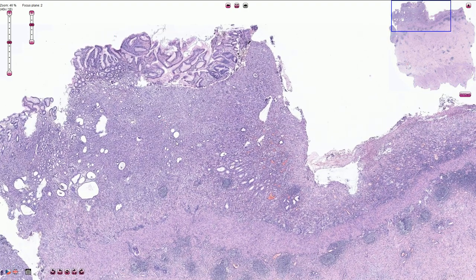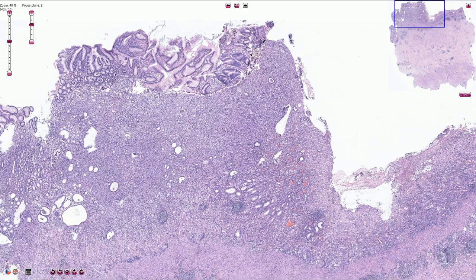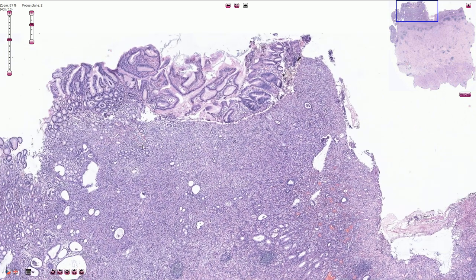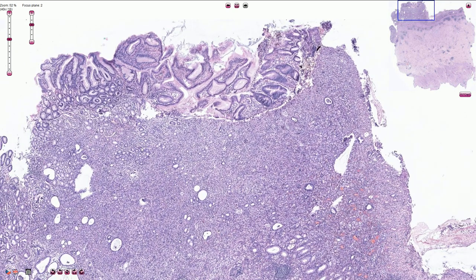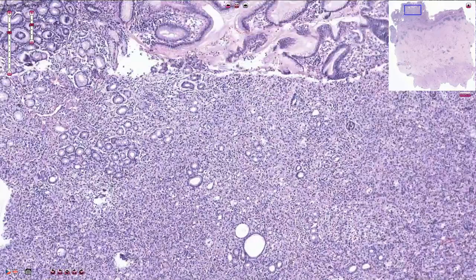Because this type of adenocarcinoma does not create glands, it is sometimes really easy to miss, especially in small superficial partial biopsies. Here we have the surface of the gastric foveoli, here we have some antral glands, and in between the cells there is malignant infiltration.